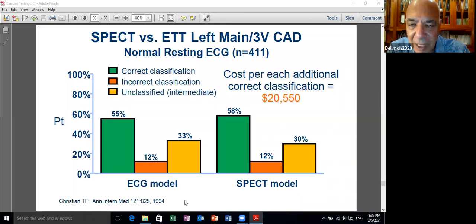تقرا منه لانك ممكن تلاقي اس تي ديبريشن بسبب الريبولاريزيشن تشينجز اللي موجوده في الاندوكارديوم، لكن rather than اس تي، احنا بيهمنا جدا ان احنا ما نقراش من وان سنجل ليد، ان احنا نقرا من فرايتي اوف ليدز. مفيش coronary artery anatomical coronary artery supply area that can be depicted by one single lead. وبالتالي عشان كده بقول لك بص في 3 ليدز.